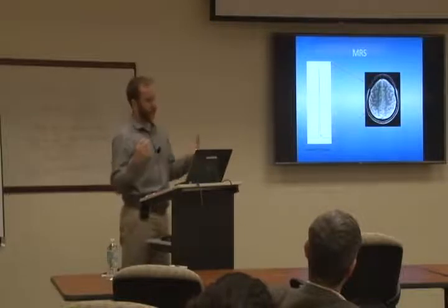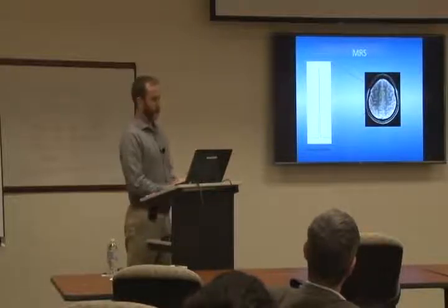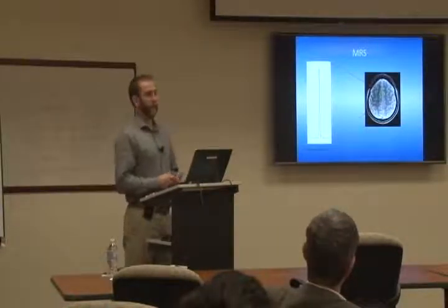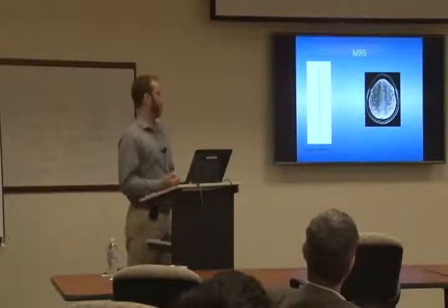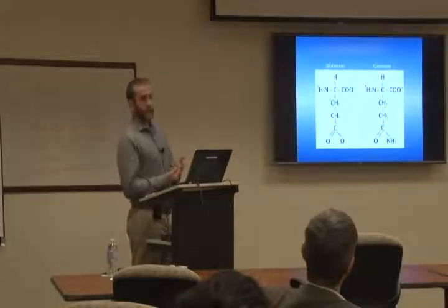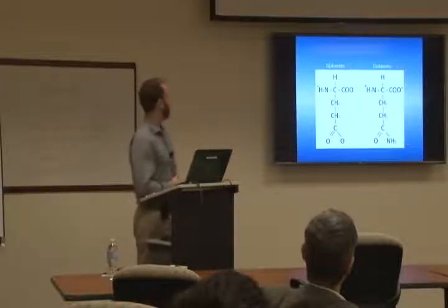And just because I spent so much time doing spectroscopy, and I've talked about it a lot, I figured I'd give you a brief introduction on what spectroscopy is. In a very simplified way, if you take an MRI image and you look at a voxel in there, you're looking at the intensity map of water in that voxel from the 2 hydrogens from H2O. But in reality, there's actually contributions from every proton that are about 50,000 times less in concentration. So you don't see it in the voxel. It's not a meaningful contribution.